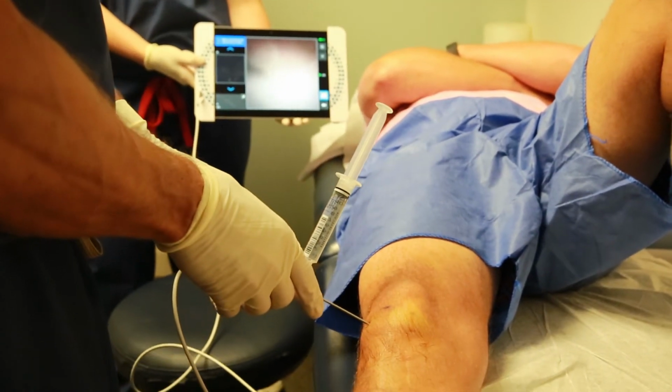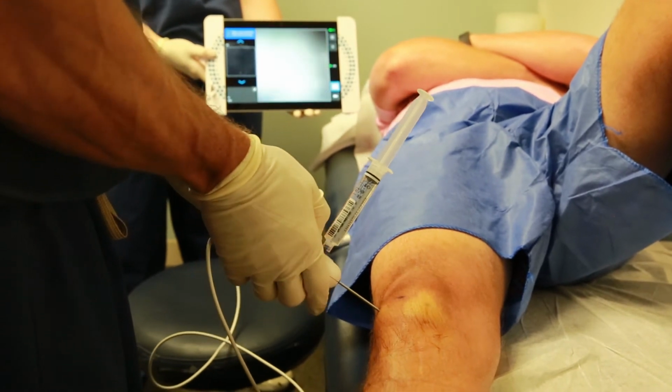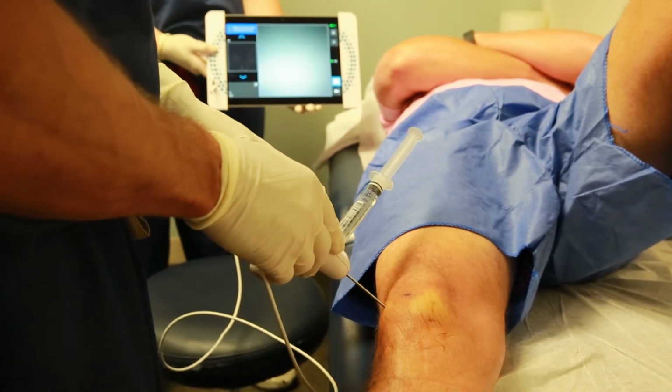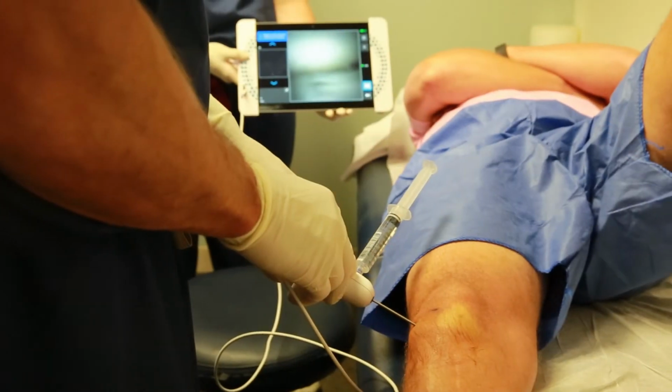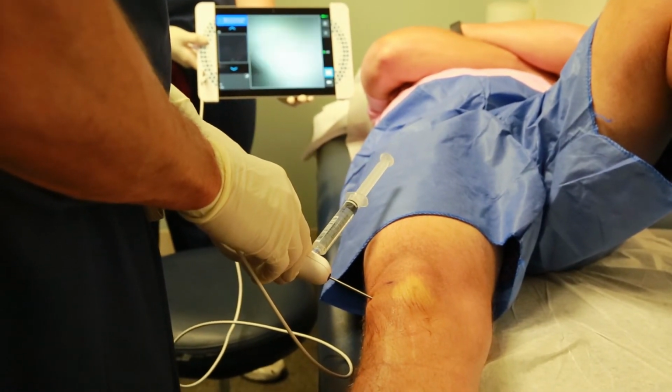And then once you get in, we can kind of feel where we are. Take your time when you get here. So now there we go. We know we're in the compartment. We can see there's his medial compartment.